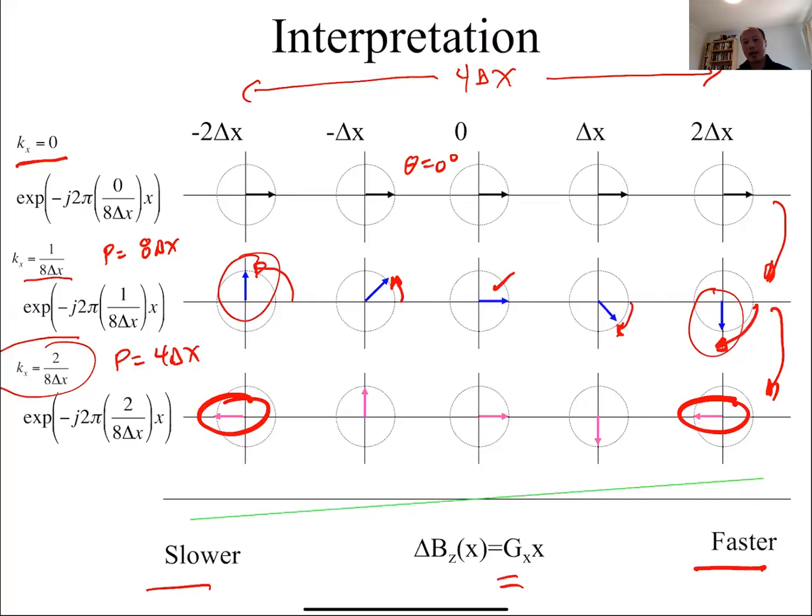As we let time go on and the race keeps going, the person in the lead is still running faster, so they will have gained even more of a lead compared to this one, and this really fast spin has got even further ahead, whereas this has lagged behind further, and this has lagged behind the most. Okay. So given this, I think that the signs for the kx and ky that we did in the initial one should probably be reversed, but we can fix that in a later presentation.